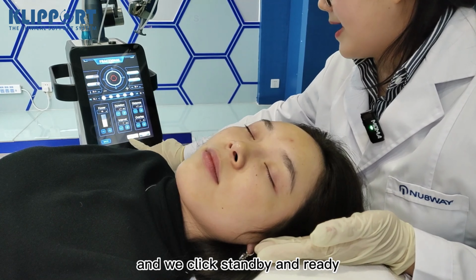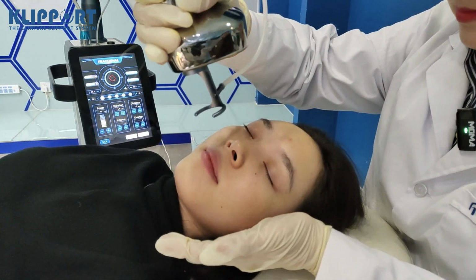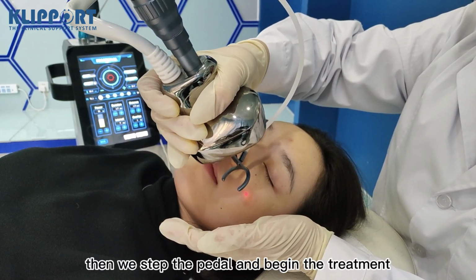And we click standby and ready. Then we step on the pedal and begin the treatment.